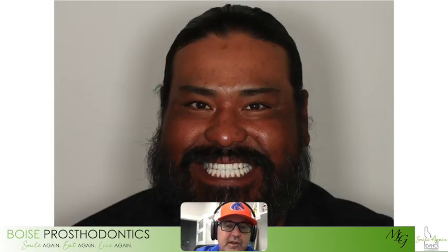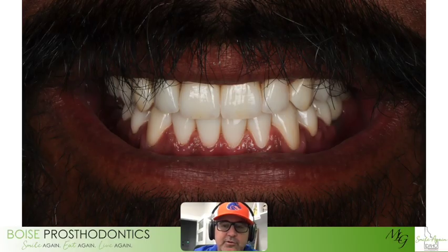Let me just show you the outcome of this case. I think they look beautiful. They turned out really, really good. So they look natural, the character in them, they fit around the gums really, really nicely. He loved them. You can see some of the detail that Dale put in them just makes them look real, even to the slight discrepancies in color of different teeth, because natural teeth have a little bit of discrepancy in the color.